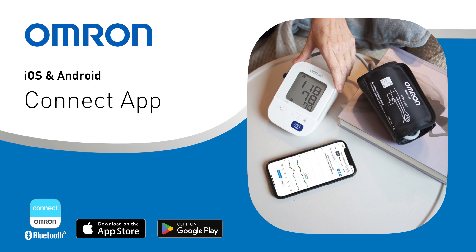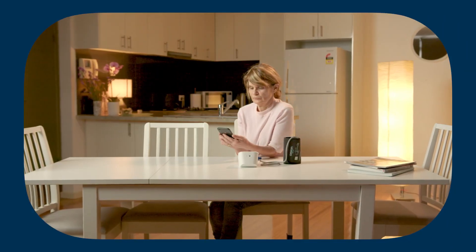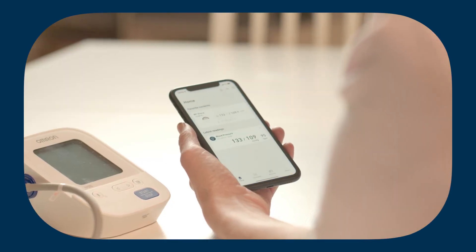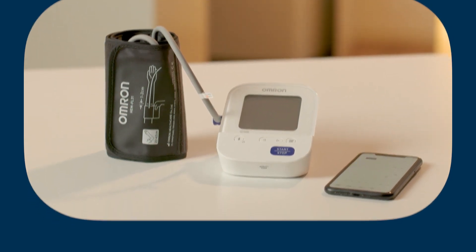How to connect an OMRON blood pressure monitor to the OMRON Connect app. OMRON Connect is an app that enables you to monitor your health smarter with OMRON Bluetooth devices. Here's how to connect your device.